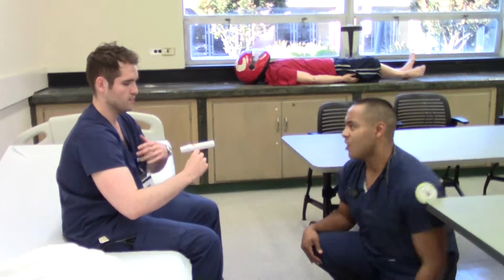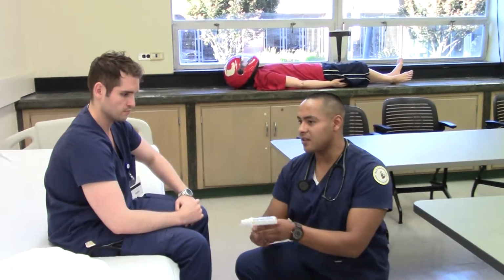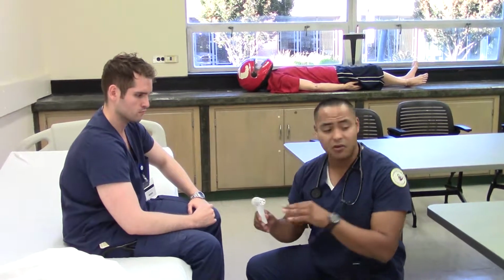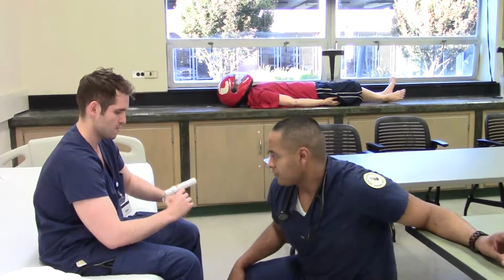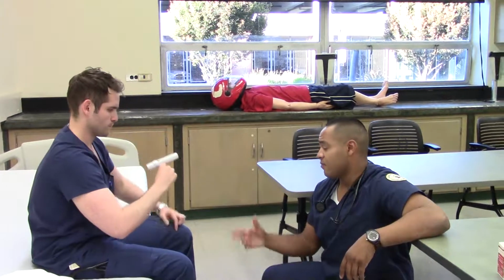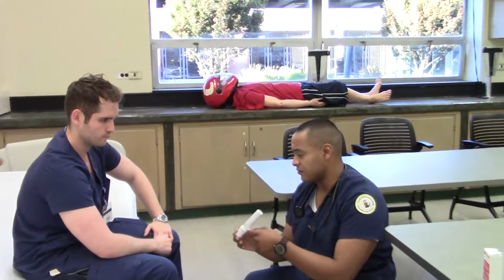Go ahead. Just take a deep breath, and breathe out as hard as you can, okay? We want to see how good this drug works, because once you leave here, if it doesn't work, you want to come back. Breathe in and breathe out. Good. Boom. That's the number. Great. It's 390.